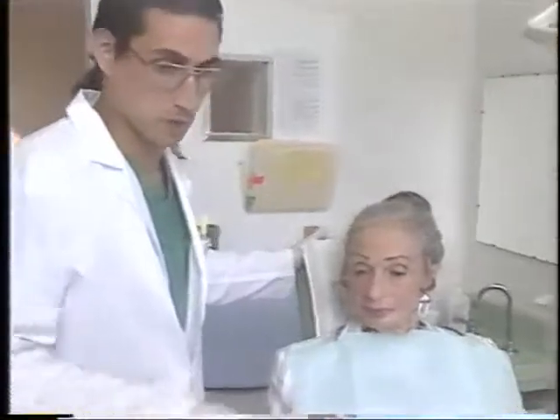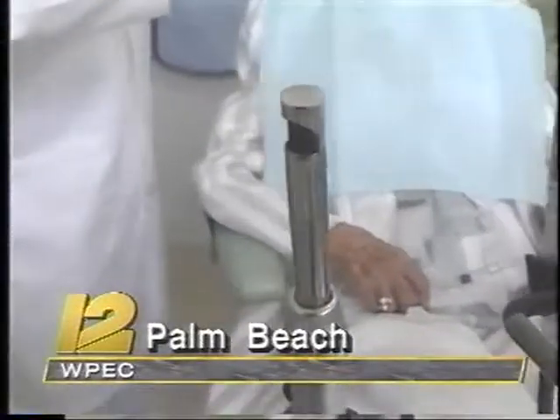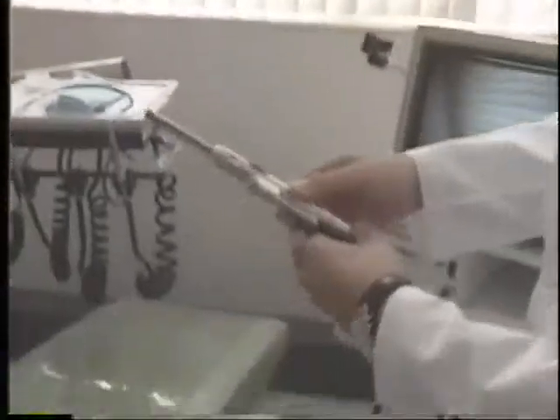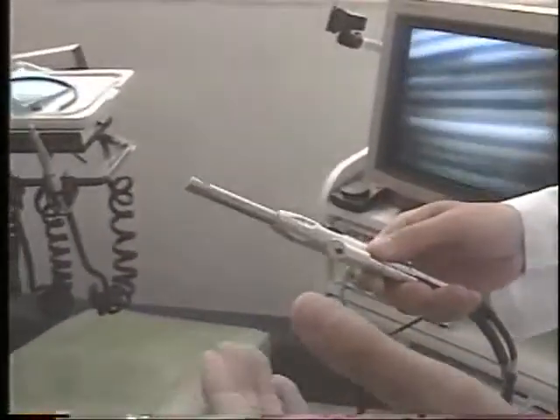Greg. Bob, Wendy, it's bad enough having your dentist poking and pulling things inside your mouth, and now some of them want you to open wide so they can take your picture. So what I'm going to do is, you're not going to feel anything. There's no radiation involved. It's just a small television camera, and we're just going to go around the mouth. Dr. Mitchell Josephs is explaining to his patient how his new high-tech camera will take some detailed and graphic pictures. It is a miniature camcorder, basically, that's small enough to fit in the mouth.